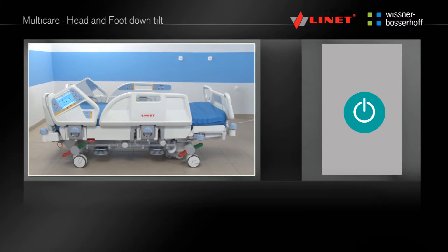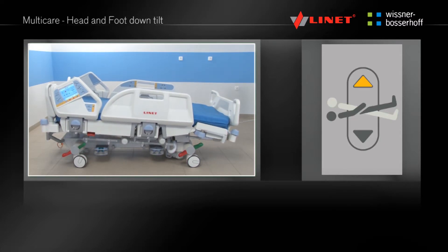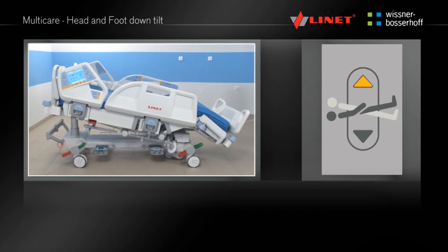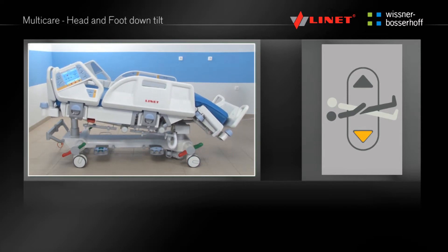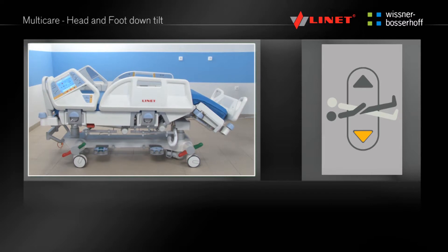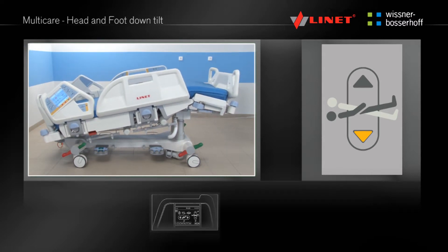Activate the function by pressing the Go button. Press and hold the function button until the desired position is reached. In contrast to the red Trendelenburg button, here the mattress platform is not flattened. The backrest and calfrest stay in position and the mattress platform can be tilted to the desired angle. This function is located on the integrated side rail controls and the Supervisor panel.